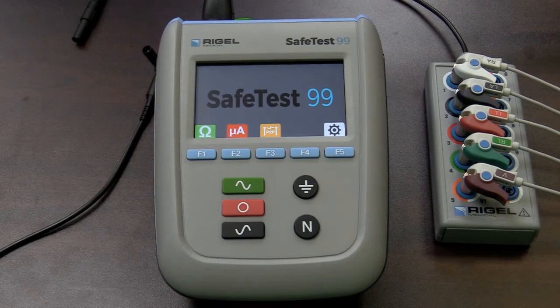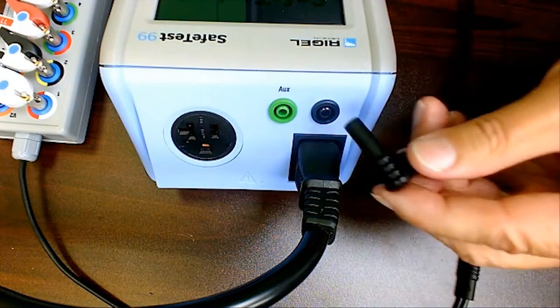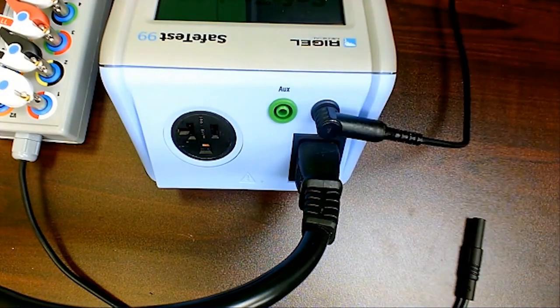Here we have the EKG leads coming from a patient monitor. Let's take a look at the other connections on the SafeTest 99. We have the power cord input to the 99 itself. Right above that, we have a banana jack where we will connect our Kelvin cable going to our device under test. We have the green-marked AUX for auxiliary, which is the connection for our second lead if we were doing point-to-point measurements. And then we have the 20-amp socket for the device being tested.